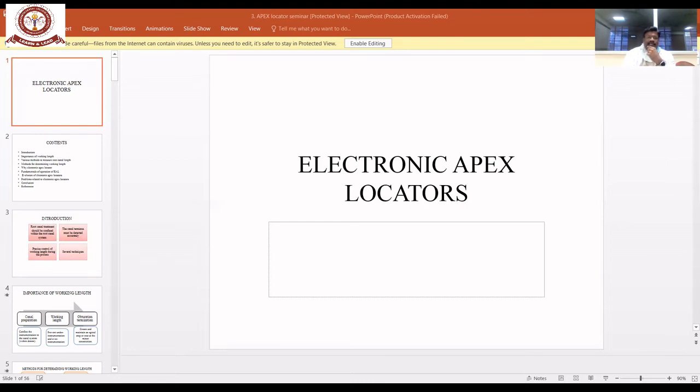In 1918, Custer determined the root canal length by using electrical conductance. In 1942, Suzuki found that the electrical resistance between the PDL and the oral mucosa in dogs was a constant value, that is 6 kilohms. This is the principle behind the apex locator. In this picture, you can see a file and a lip clip. As the file reaches the apical foramen, the length of the resistive material, meaning the resistance towards the current, decreases, since the distance between the conducting medium and the apical foramen decreases.